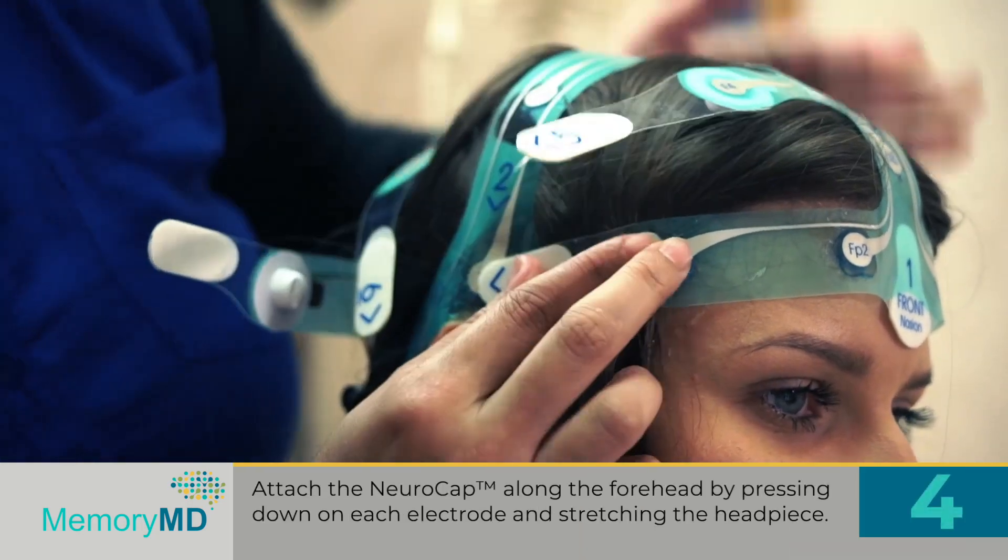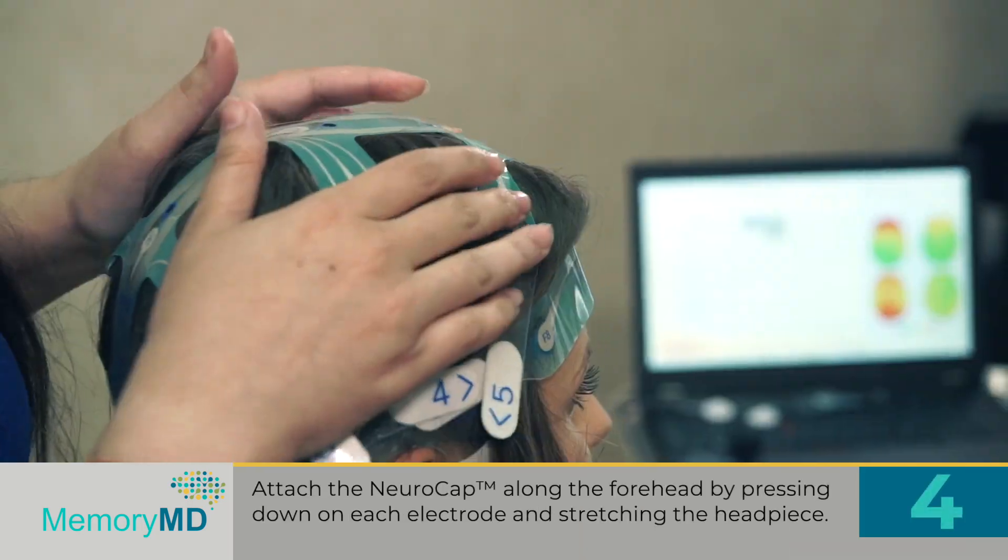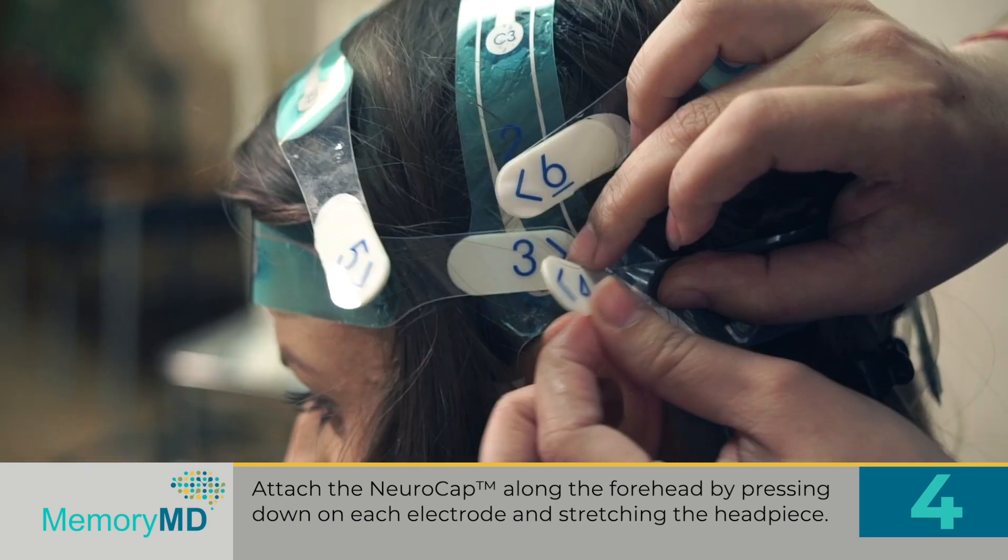Step 4: Attach the NeuroCap along the forehead by pressing down on each electrode and stretching the headpiece.